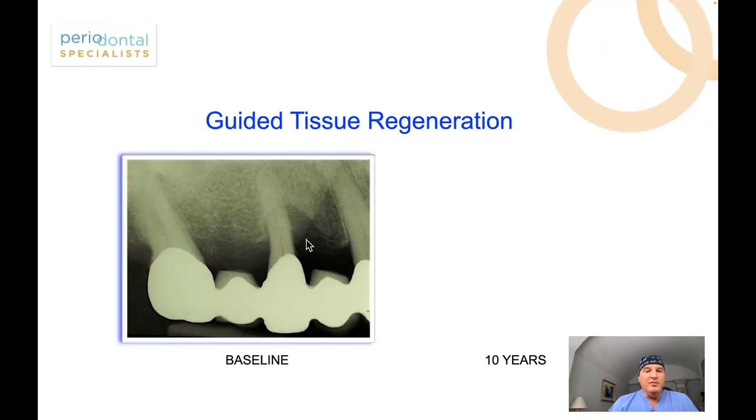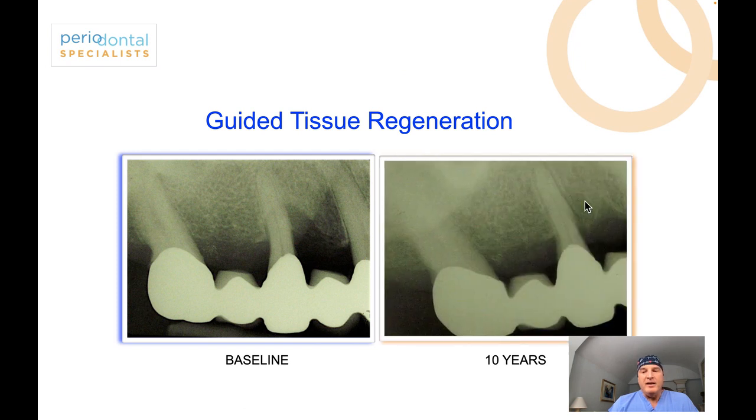And we can see before surgery and after surgery, and you can even see an outline of the bone that we rearranged through the fracture technique and then the new bone taking hold.